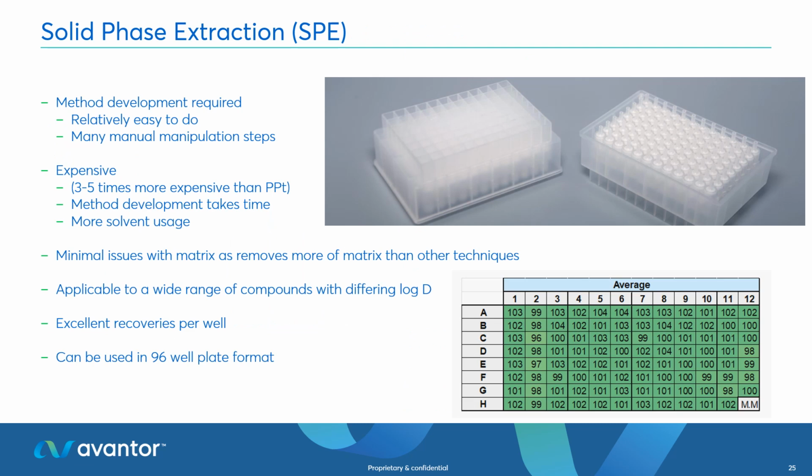So we've now got our chromatography. Now we need to start focusing on our extraction methodology. And so in this case, we'll be using solid phase extraction. So the method development is relatively simple. I'll talk through a process where we can go through and optimize the chemistry relatively quickly.